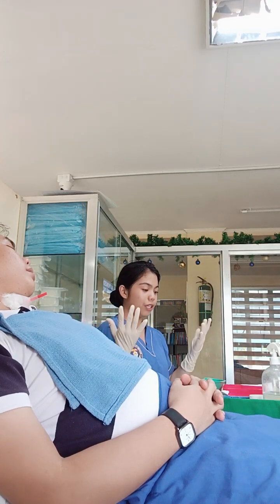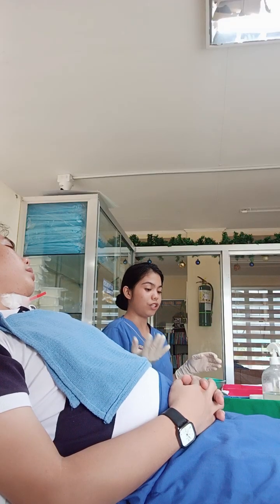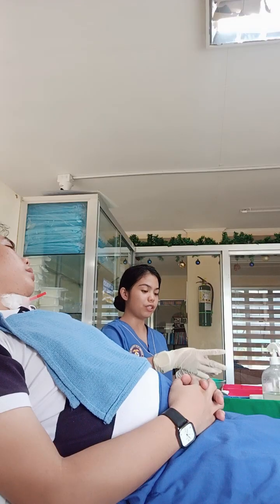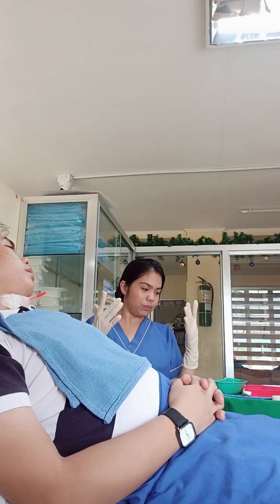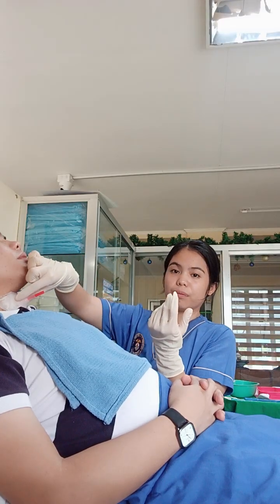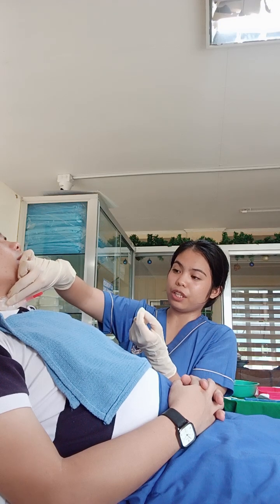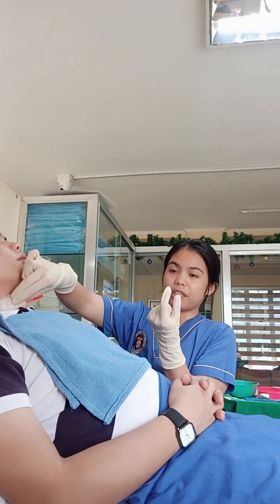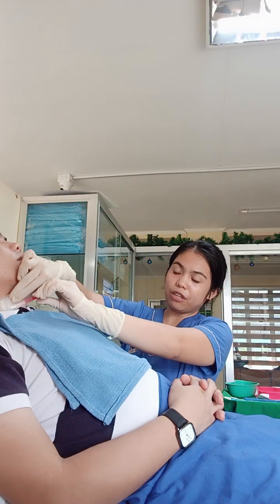Now that I have prepared the solutions and opened all necessary equipment, such as the tracheostomy dressings, the sterile applicators, and the suction catheter, now I will be removing the inner cannula of the client. So in removing the inner cannula, you have to make sure that it's secure by only securing the external cannula, holding it at the flange, and then only grasping the exterior part of the inner cannula. You take it out slowly and gently in line with its curvature.